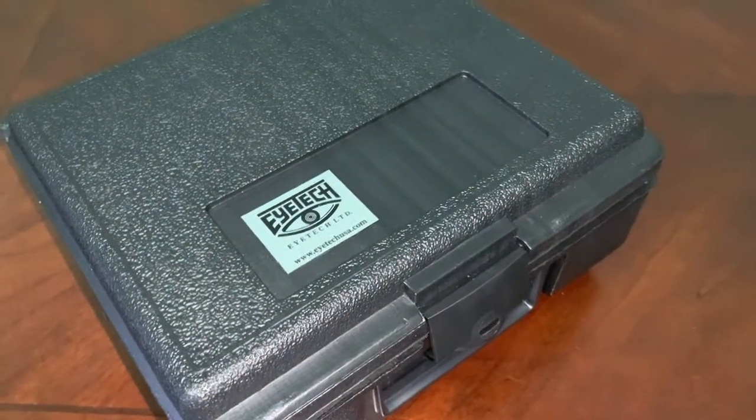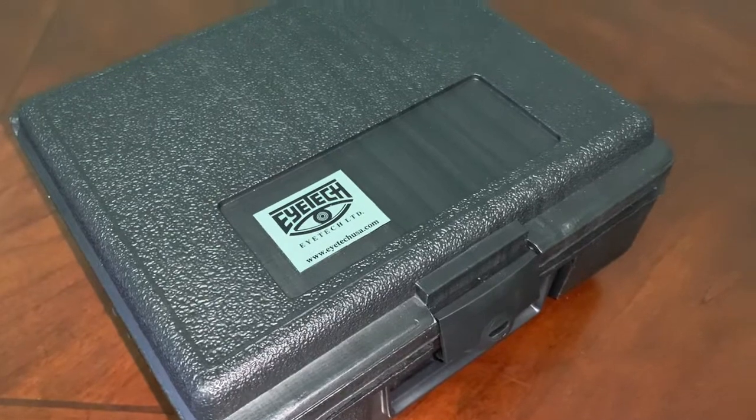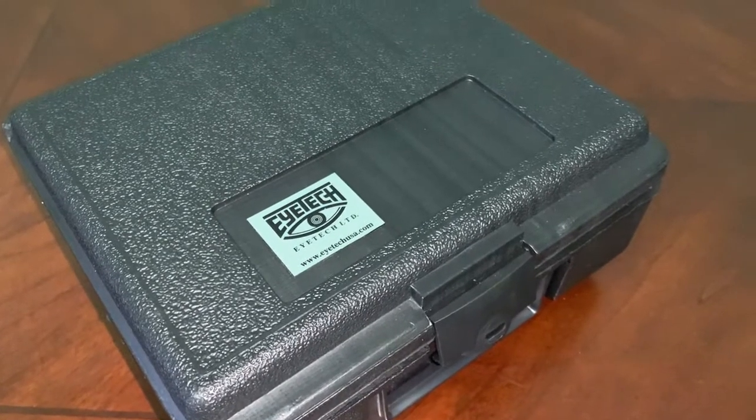Hi, this is Sharon with iTech Training. I wanted to share with you a device which I use for training, and honestly I wouldn't train without it.